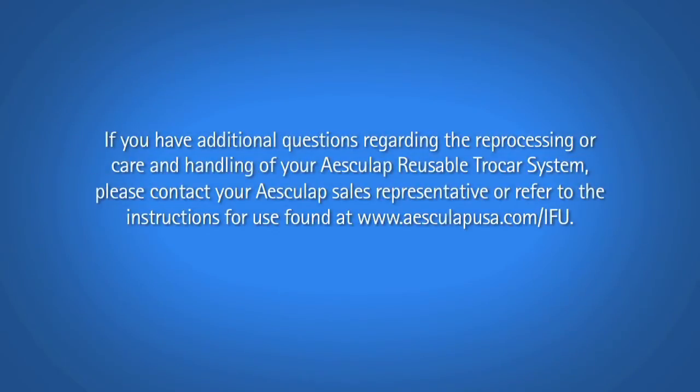If you have additional questions regarding the reprocessing or care and handling of your Aesculap reusable trocar system, please contact your Aesculap sales representative or refer to the instructions for use found at www.aesculapusa.com/ifu.